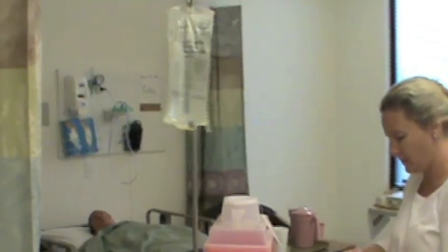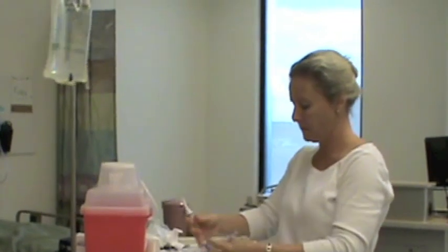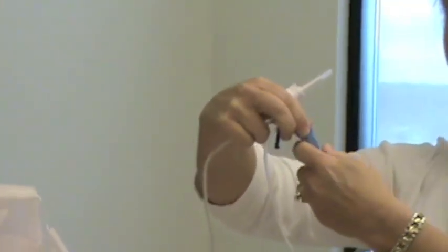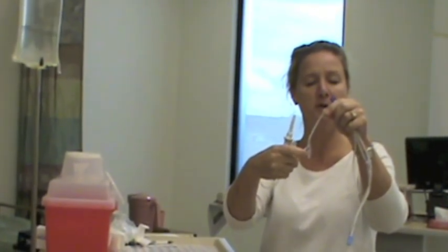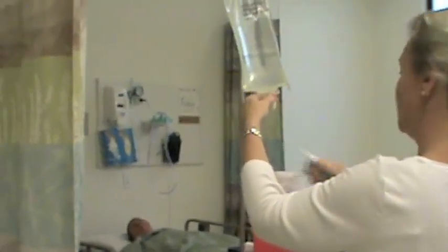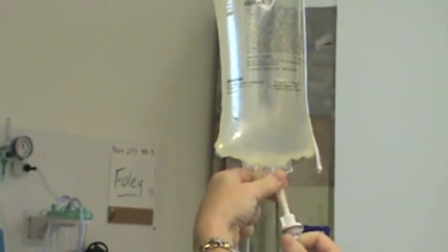Next I'm going to open my tubing and take the paper off of it. The first thing I want to do is clamp it with the roller clamp. Then I want to spike the bag, but I need the air to be purged through all of the ports. As the solution comes down, I'll hold each port upside down so the fluid displaces the air in the cap. I'm gathering the tubing in my hand and maintaining sterility of the spike — twisting and pushing without touching the spike itself, only touching above it.